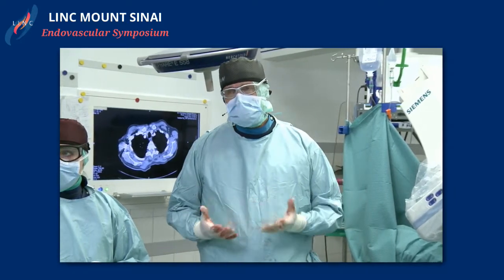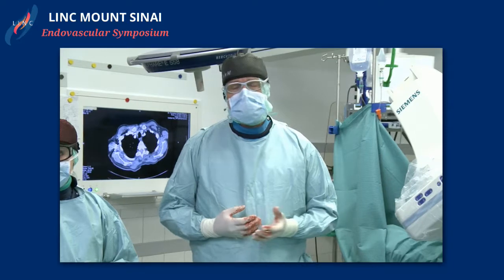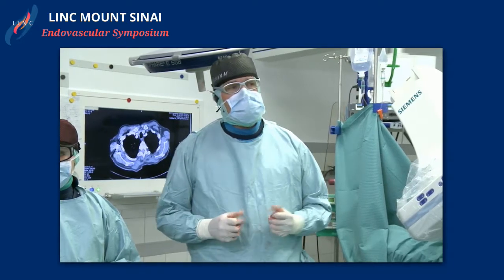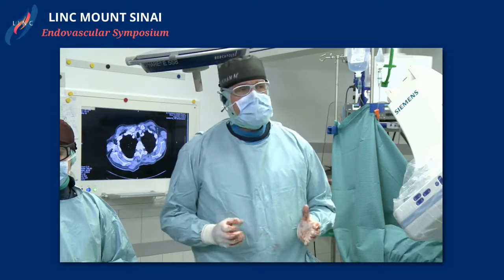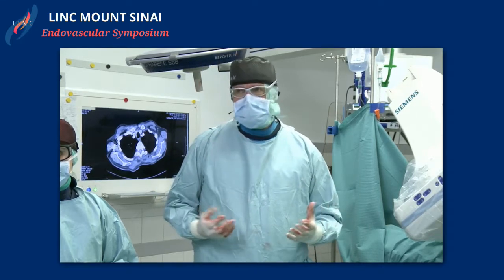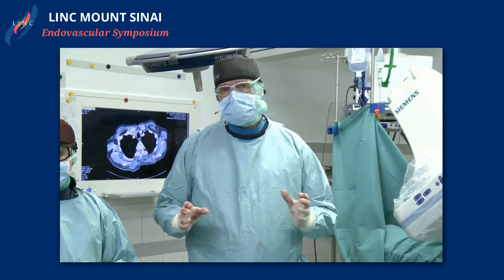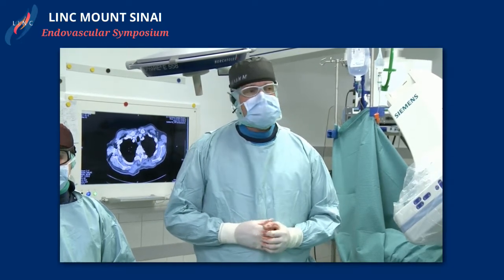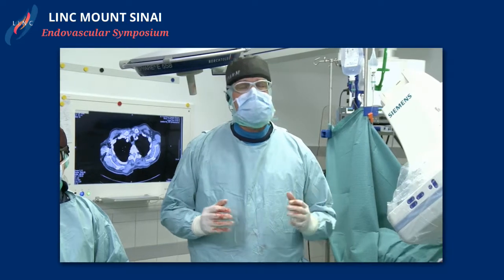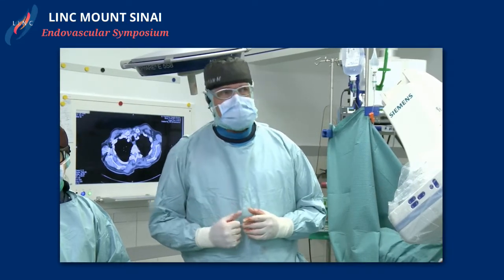With a reason: our patient is 81 years old, and our reconstruction has not to last forever. We want to treat him safely, and we don't want to have, for example, a cerebral infarct or something like this, and therefore we decide only to use one chimney from above.